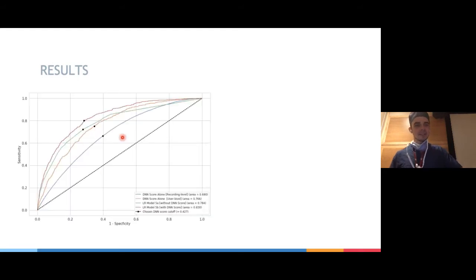So here again, you can see four different area under the curve, ROC curves. First of all, if I start with the blue one, this is the performance of the AI classifier in classifying a single 20-second PPG recording obtained from a smartphone. And you see it has weak performance, an area under the curve of 68. Then if you average all the performances in an individual, you end up with an area under the curve of 76, so slightly better.